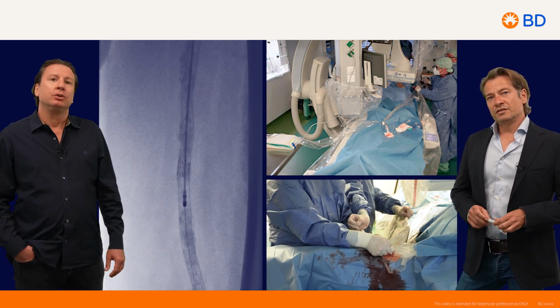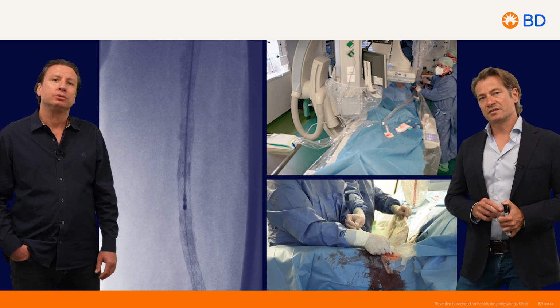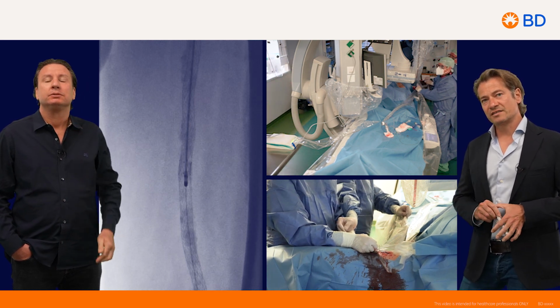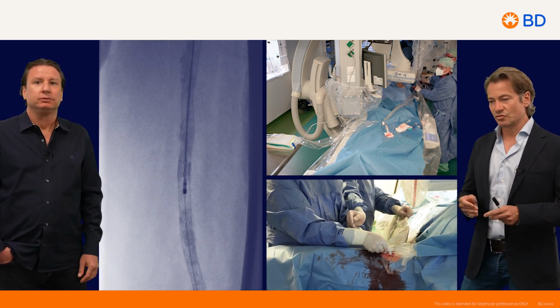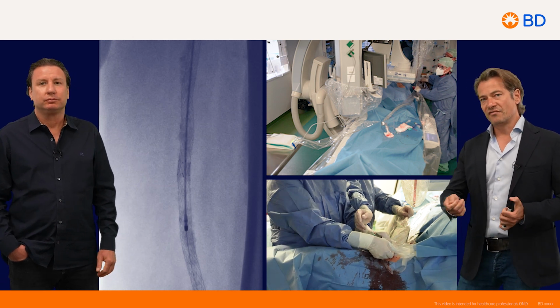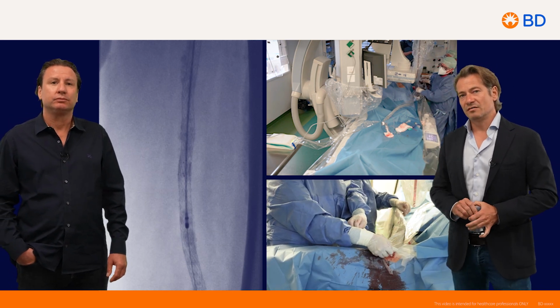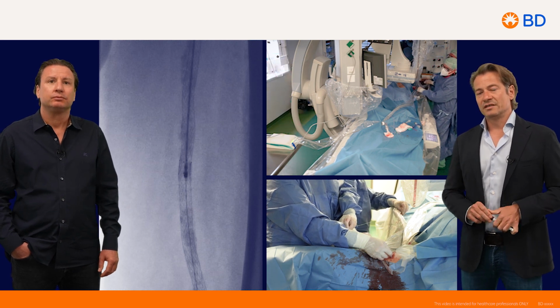But here you see that the Rotarex is going very deep into the area where the stenosis was, and we try with 4 hands to push the device slowly down, which is also a little bit difficult coming from the arm, not to jump forward, but always we have movements in the device to be able to suck some material out, atheroma, thrombus, whatever is located in the vessel.